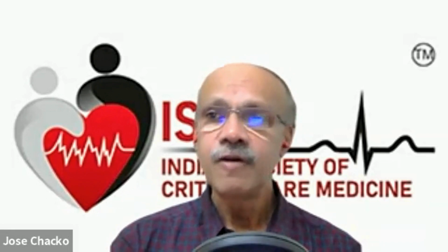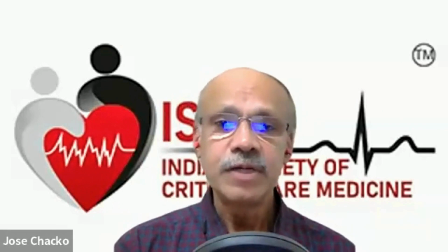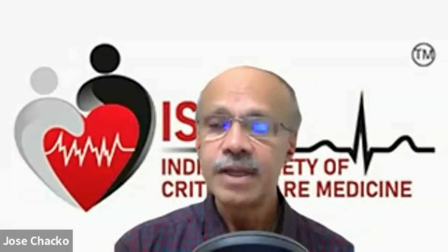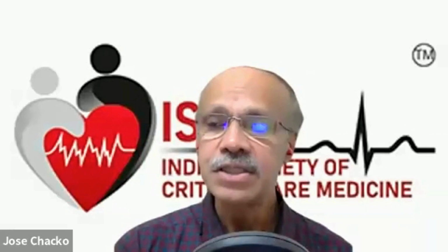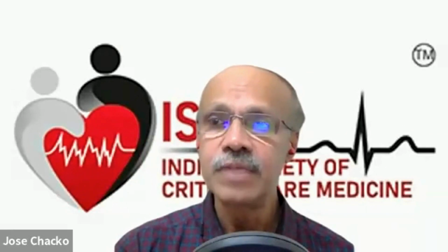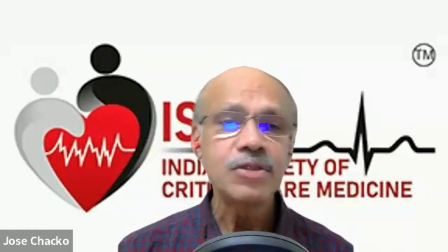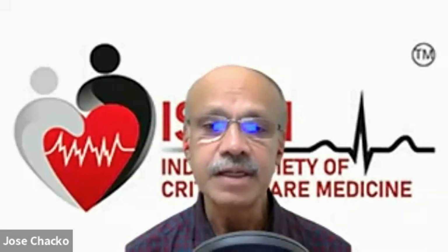It will allow you to follow up your patient with ARDS and actually see if they are getting better over time or getting worse over time. If you do it, say, a couple of times every day, it'll give you a good idea about how much they are progressing in terms of improvement or deterioration. The second most important reason as to why I would use ultrasound in my practice is to look at recruitability. This is a very important question.